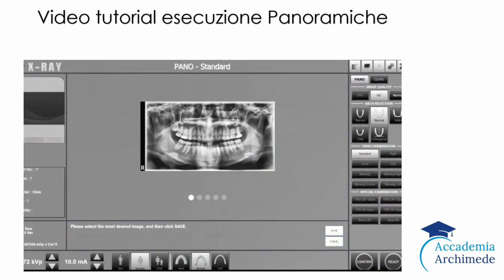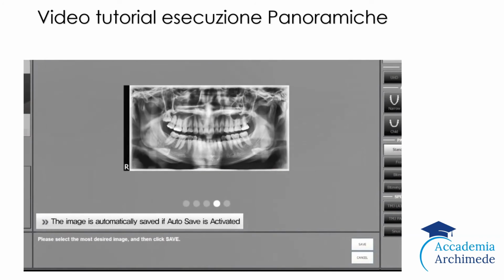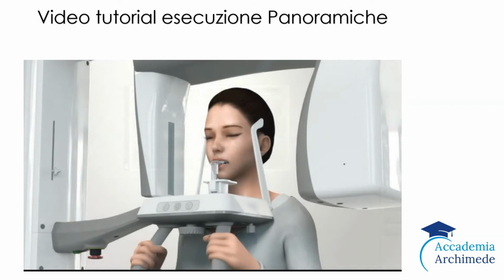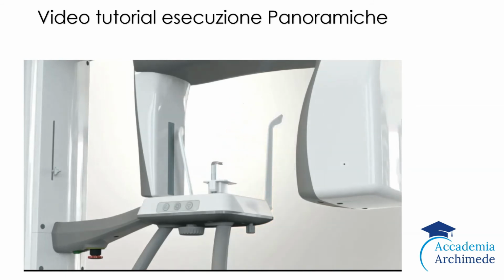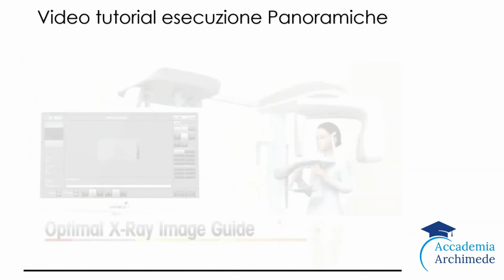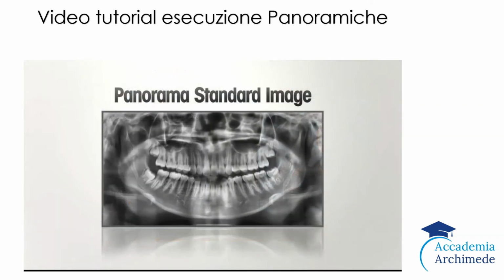After the image acquisition, save the captured image. If you purchased a license for AF mode, select and save the optimal image using the mouse wheel. If manual save is set, click the Save button to save the image. After the image capturing, unfasten the temple support. Then guide the patient out of the unit. Check the captured image.